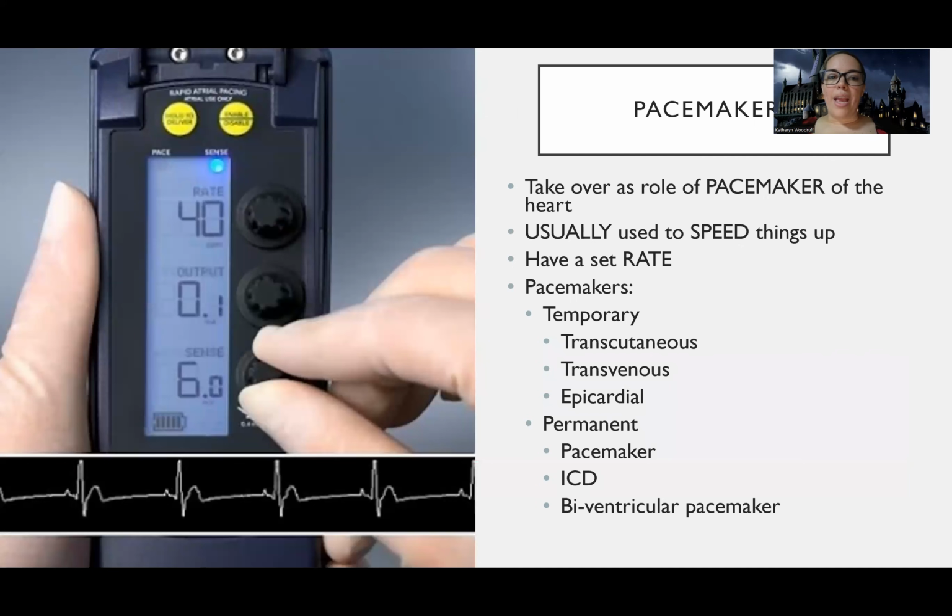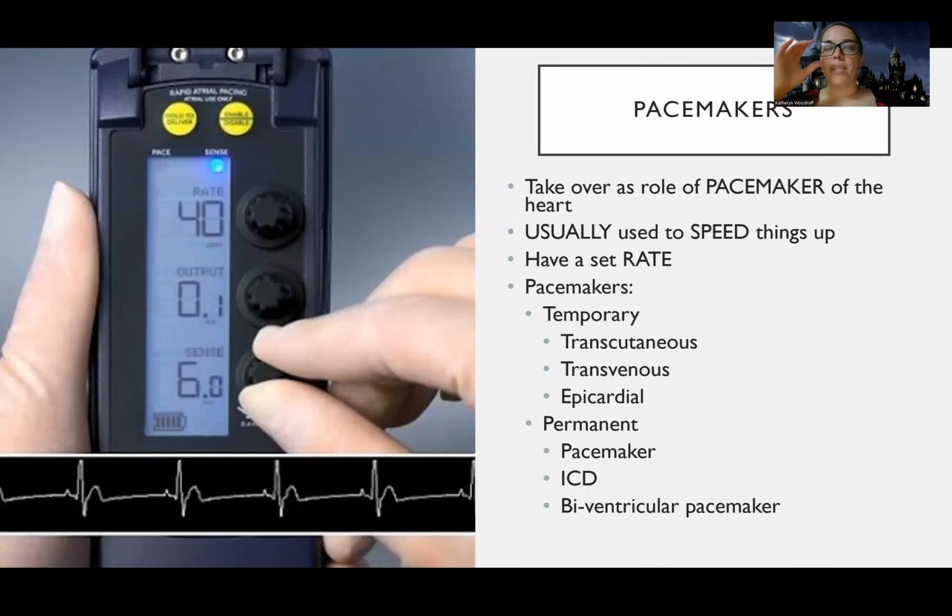So a pacemaker is a device. It is an electronic device. And effectively, remember how I said that a sinus rhythm comes from the SA node. That is my pacemaker of my heart.